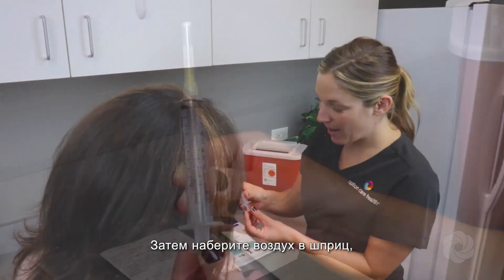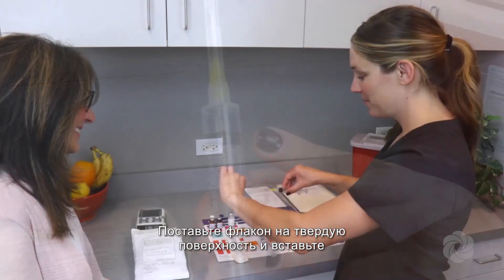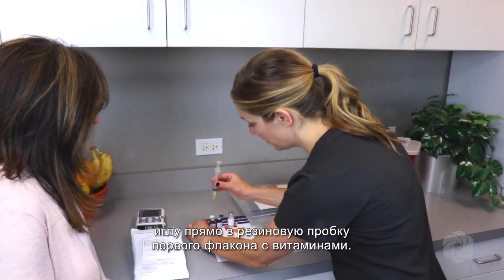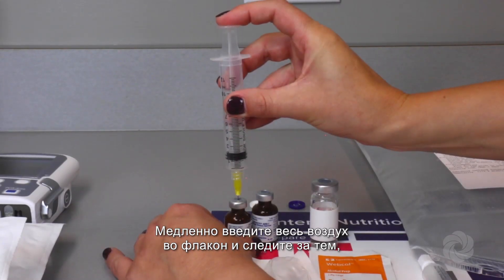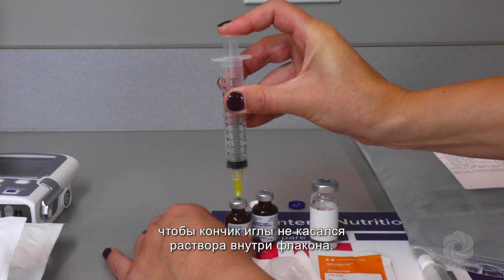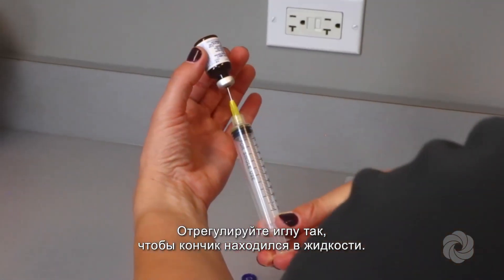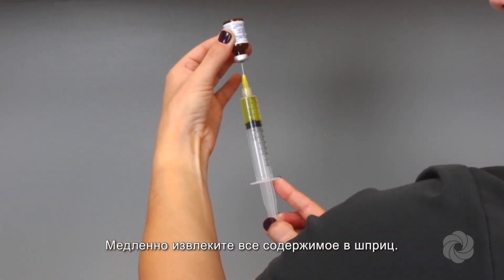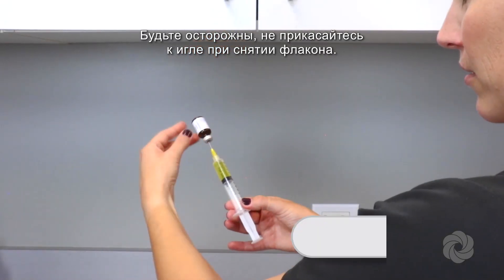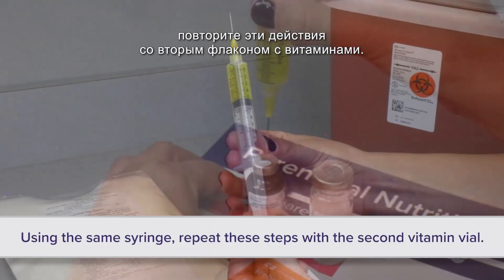Draw air into the syringe by slowly pulling back the plunger to the two milliliter mark. Place the vial on a hard surface and insert the needle straight into the rubber stopper of the first vitamin vial. Slowly inject all of the air into the vial, making sure not to touch the needle tip to the solution inside the vial. Pick up the vitamin vial and turn it upside down. Adjust the needle so the tip is in the fluid and slowly withdraw all contents into the syringe. Be careful not to touch the needle when removing the vial. Using the same syringe, repeat these steps with the second vitamin vial.